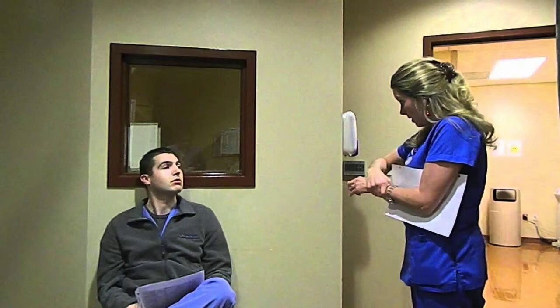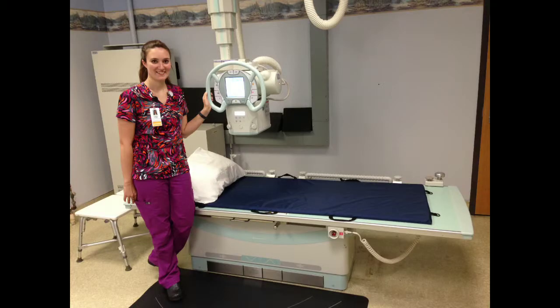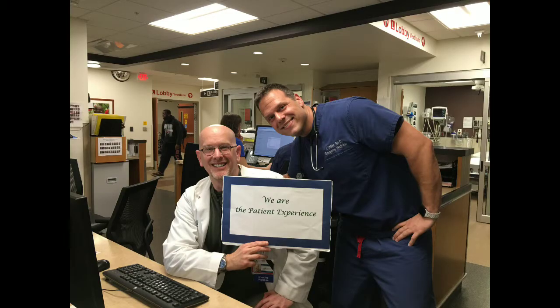The second step, introduce yourself, tell them who you are. The third step, let them know how long the x-ray is going to take. The fourth step is to explain the exam, address any concerns, and give clear instructions while positioning the patient for that particular view. The last step is to thank the patient or family for being part of their care.